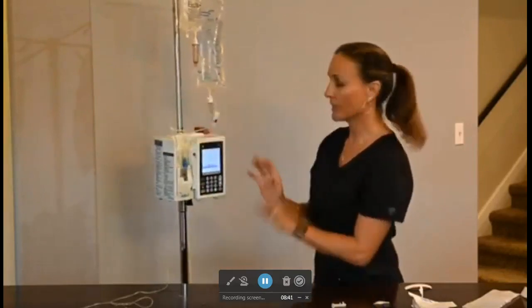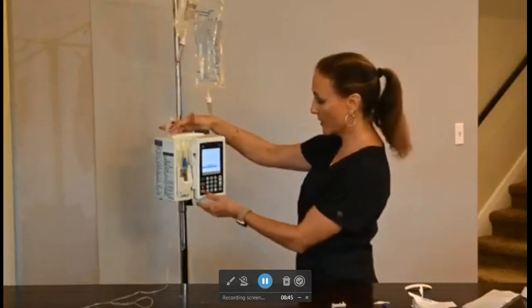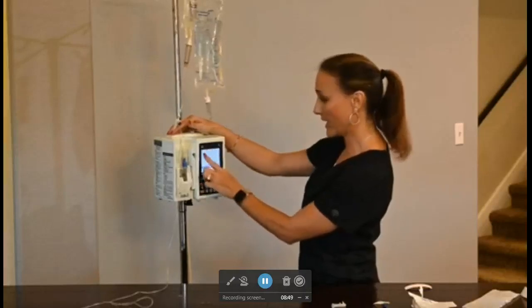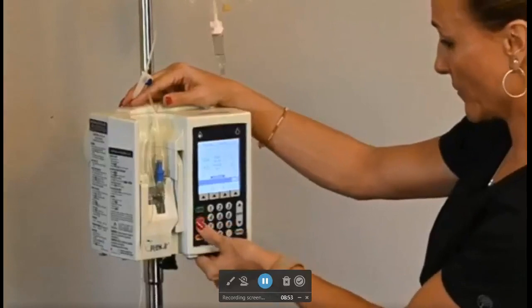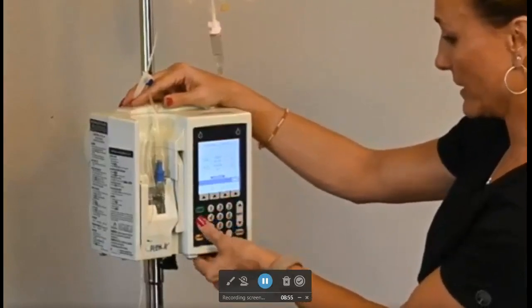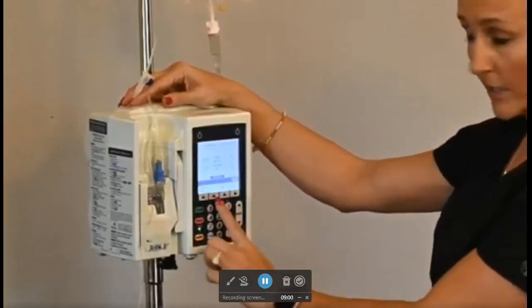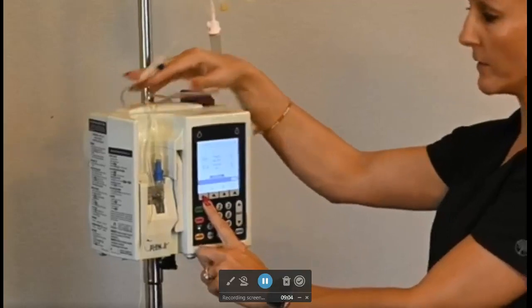Now what I'm going to do is I'm going to open this up, I'm going to have to come to my pump, and I'm going to have to say it's running, the A is for the primary, the B is for the secondary. I'm going to have to come over here and say stop. There's a button right there. And I'm going to have to hit my back prime button and watch what happens when I open this up.